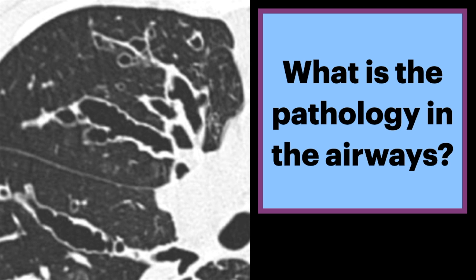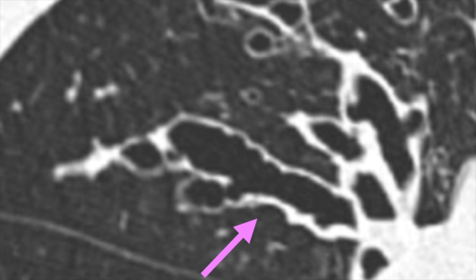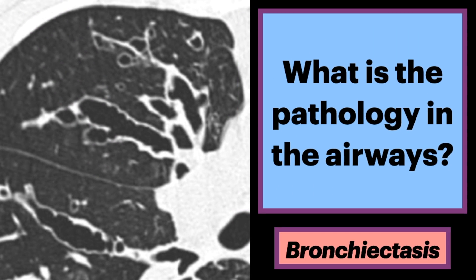What is the pathology seen in these airways? On this axial CT of the chest, we see large dilated airways. All airways are diffusely involved, and the walls are irregular, resembling a varicose vein. The answer is bronchiectasis, particularly the varicose variety, which we will describe later.